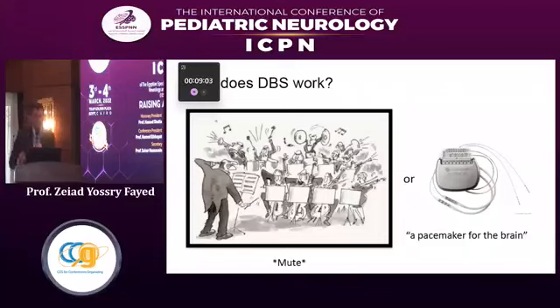Well, we do know that it works, but how does it exactly work? We do not have that much knowledge, but there were theories that it inhibits the abnormal signals. Another more recent theory is that it stimulates the abnormal under-firing of certain nuclei, and then more recently it's thought that it does resynchronize or re-rhythm the abnormal firing of different nuclei or structures.